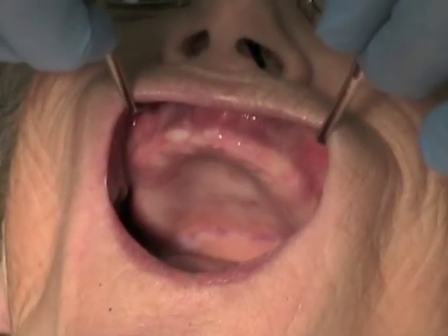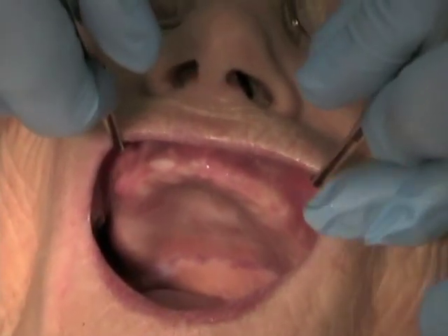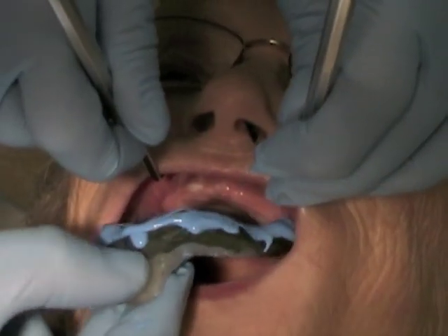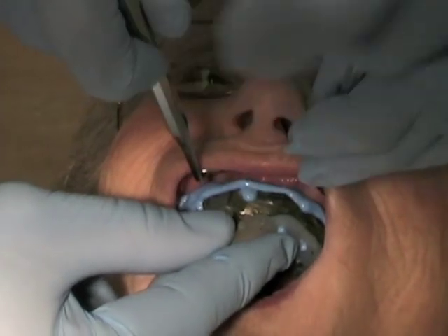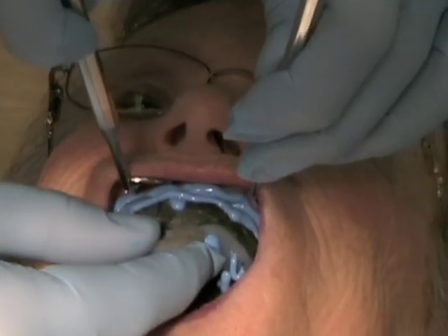The patient should be instructed to relax their cheeks and lips. Retract the lip so that neither the tray nor the impression material contact the lips during insertion. Seat the anterior portion of the tray first, aligning it with the labial frenum, and then rotate the back of the tray into place with the mirror still in position.